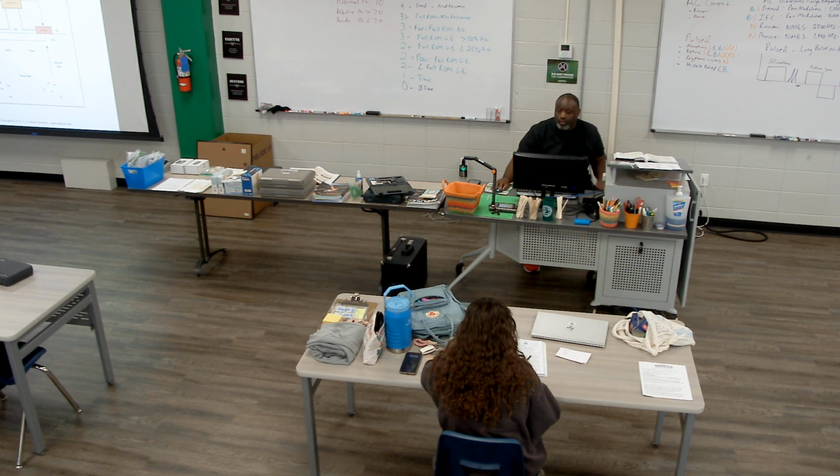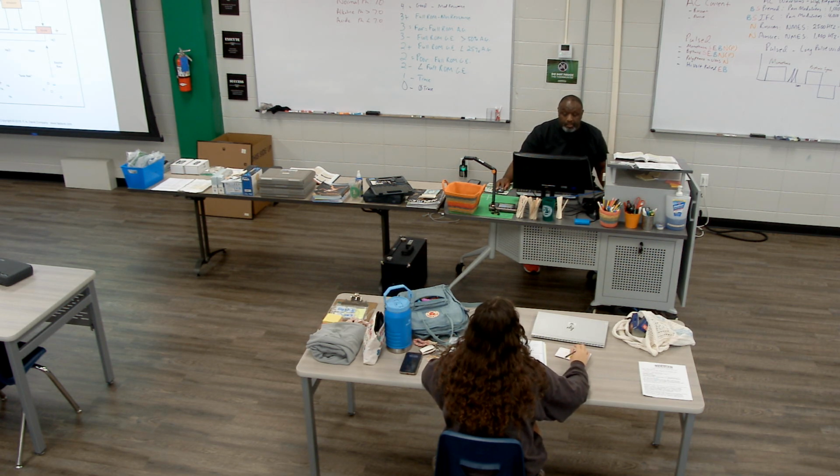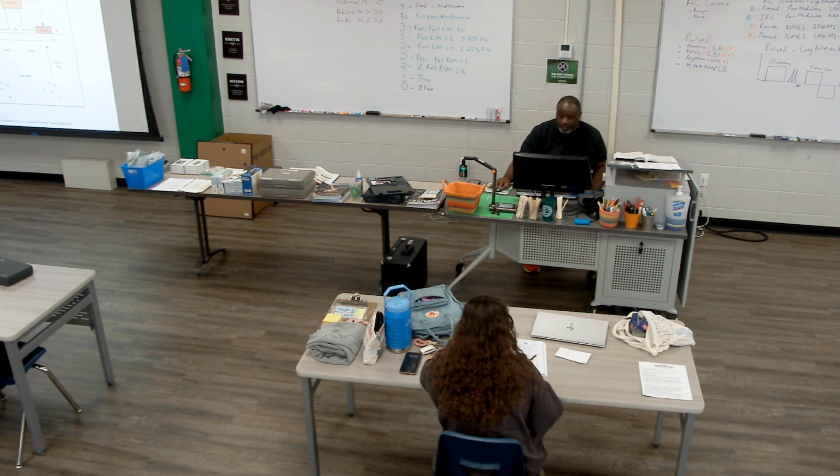You can get what's called a bone stimulator for fractures that are non-healing or that are healing very slowly. They are prescribed by a physician specifically. We don't do anything with them, but patients may have one on and they'll tell you, I'm wearing a bone stimulator. So here's what it looks like.